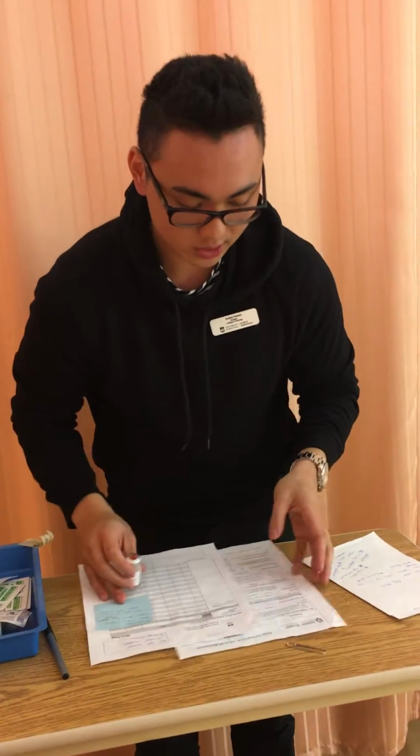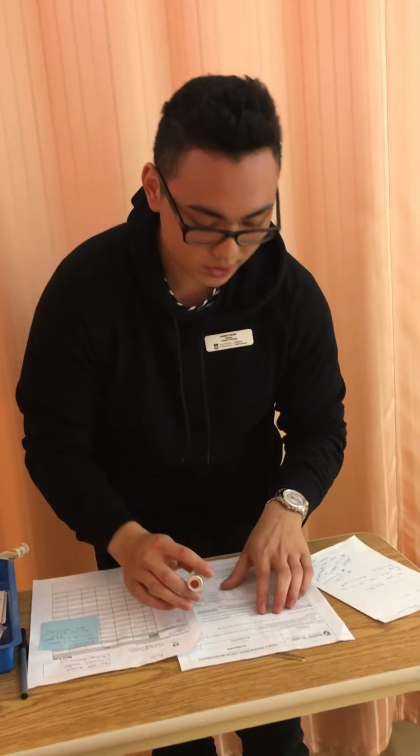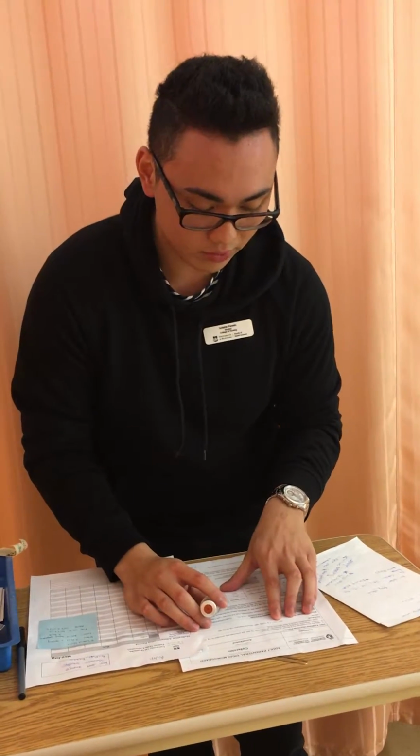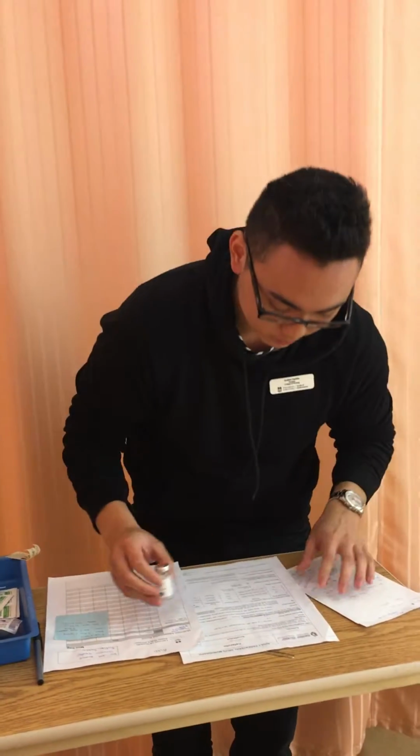And we also have to check if that dose that is prescribed is within the safe dose range. So it says that the usual dose is between 500 milligrams to 1 gram, so 750 milligrams is within our safe dose range, and our vial is enough for that medication because it's a 1 gram vial.